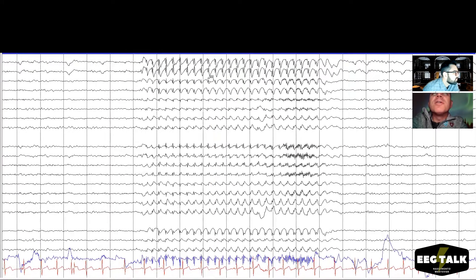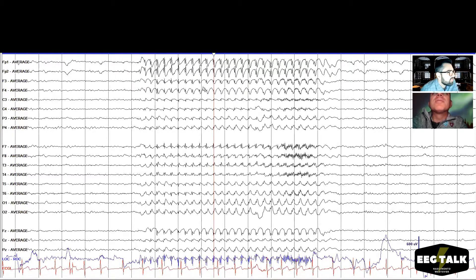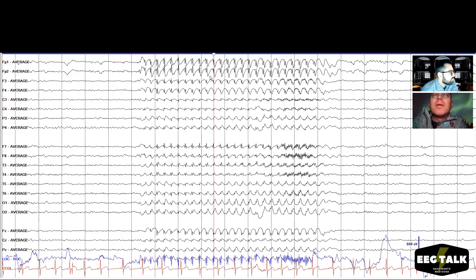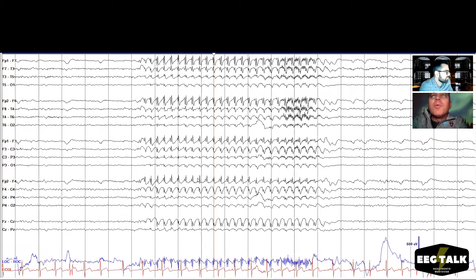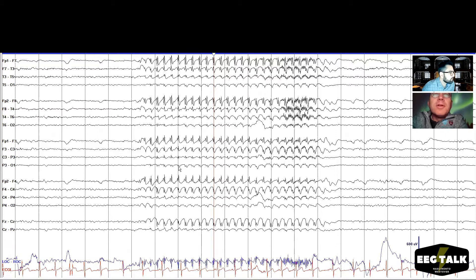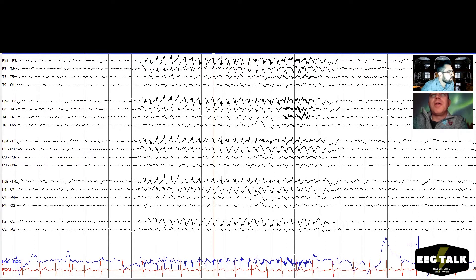Wait — if it's just in the frontal, is it focal or generalized? We still call it generalized if it's synchronized between the two hemispheres. How do we describe this? We want to give other people reading our report a clear idea of what we're seeing. We comment on frequency — looks like there are three spikes each second. So this is a pretty classic three hertz generalized, frontally predominant spike-and-wave pattern.